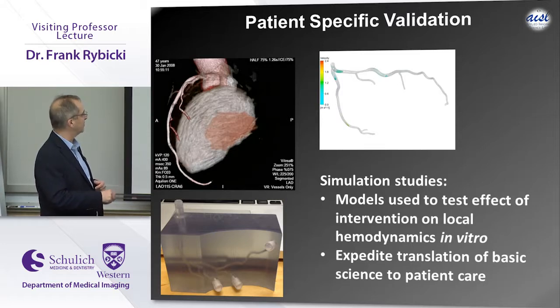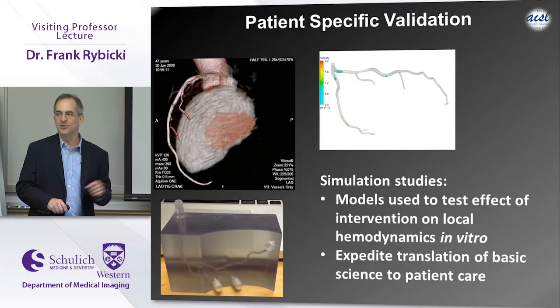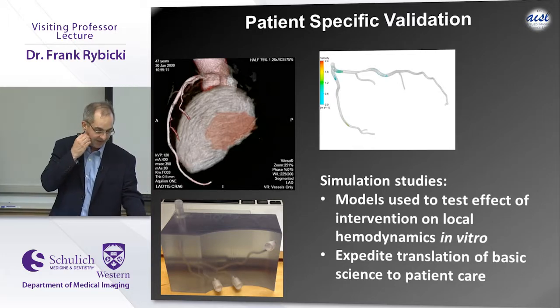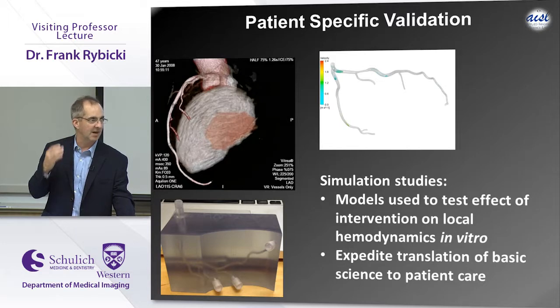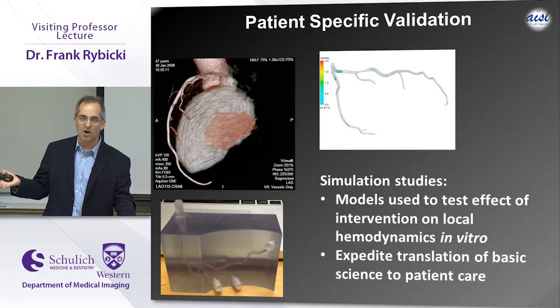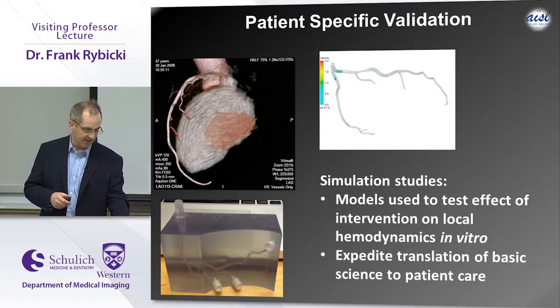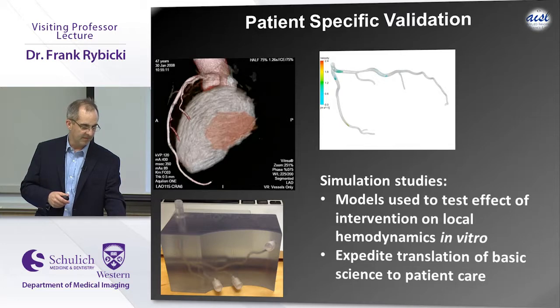You put valves on it. You can put this thing in your CT scanner, and then you can run contrast through an entire flow loop, and you can scan this 1,000 times, no problem. And all of those things that get validated, they're already being validated through 3D printed models. You can take whatever you need from the patient into the CT scanner, or even into an MR scanner if it's a compatible material, and actually run that. So there's a huge piece of this medical modeling that actually fits into the scientific arena.